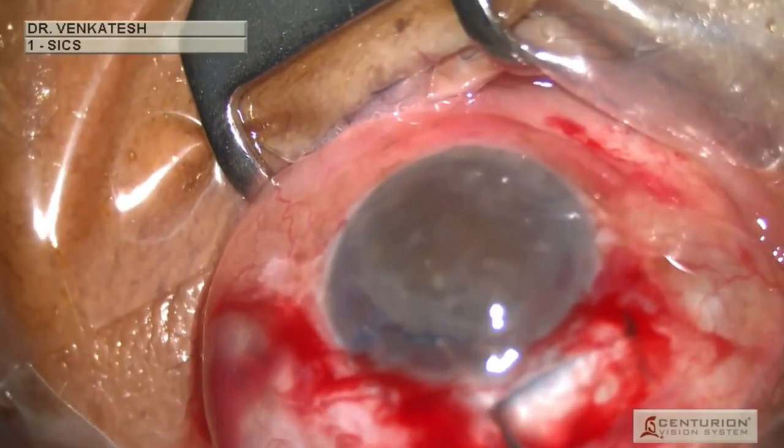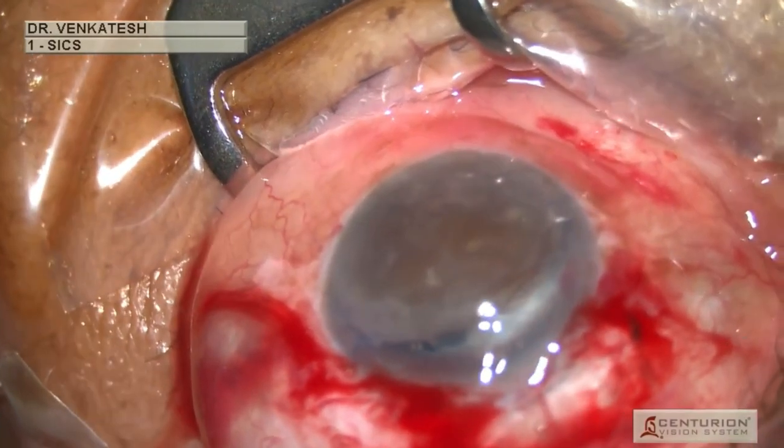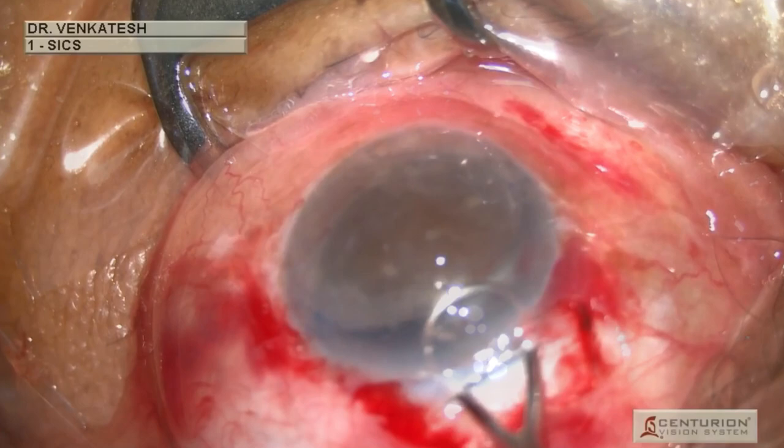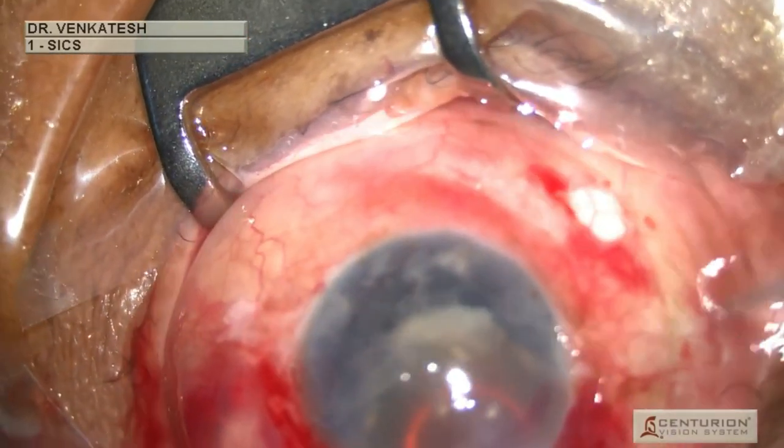Viscoelastic is injected below and above the nucleus to protect the posterior lens capsule and the corneal endothelium. Using an irrigating vectis, the tunnel is depressed and the nucleus is explanted.